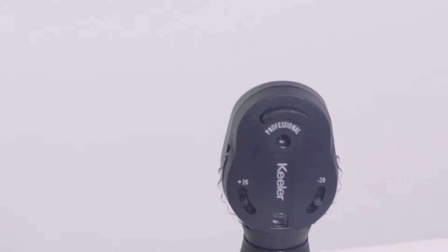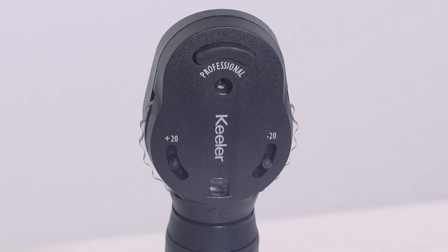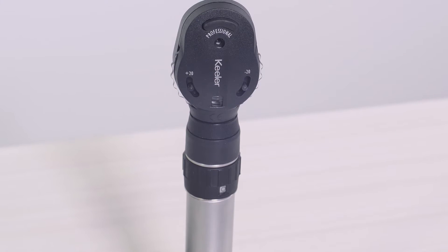The Keillor Professional Ophthalmoscope is designed to ensure ultimate control and fast examination. It features a comprehensive lens range from plus 29D to negative 30 and bright white xenon illumination.